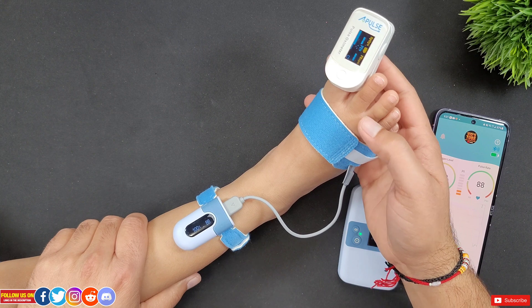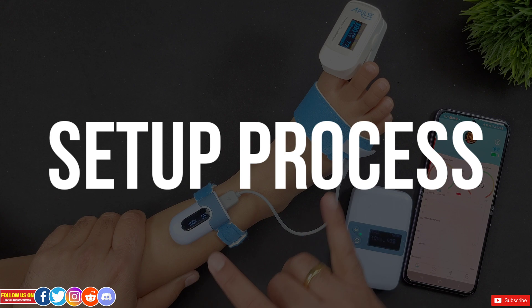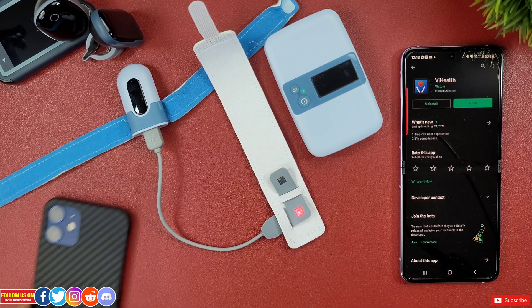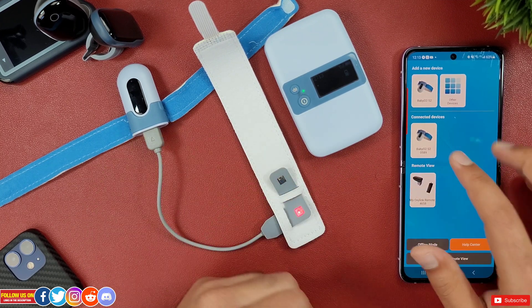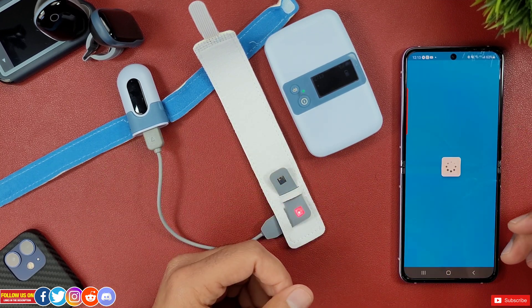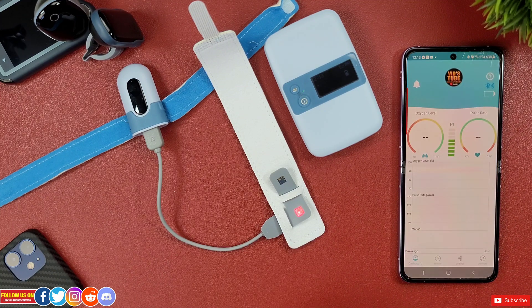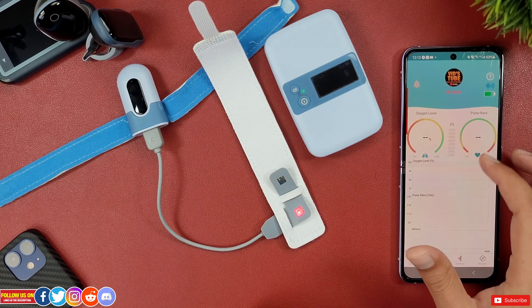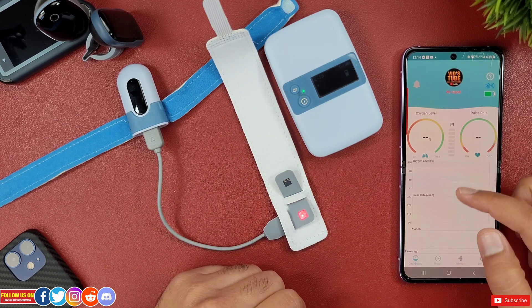The setup process is straightforward. Download the V-Health app, available free on both Apple App Store and Android Play Store. Once installed, the Baby O2 S2 device will appear as soon as you turn it on and bring it near your phone. Once connected, you get a live screen showing oxygen level, heart rate, and the PI (perfusion index), which indicates pulse strength at the sensor site, along with the Bluetooth connection icon and battery level.